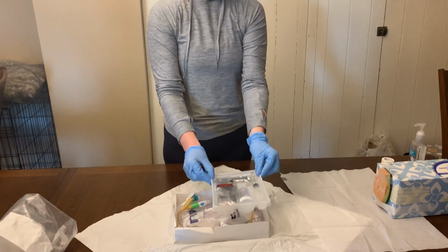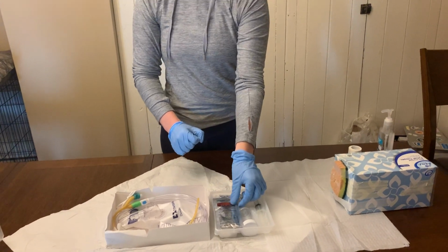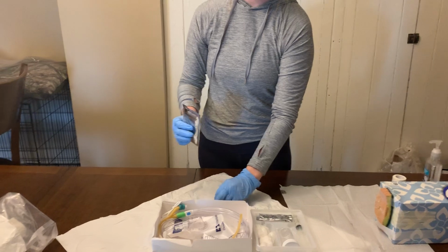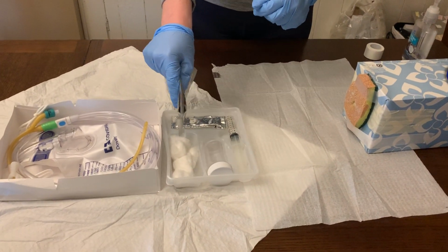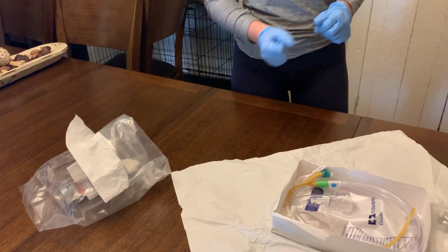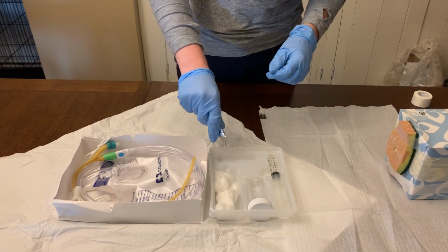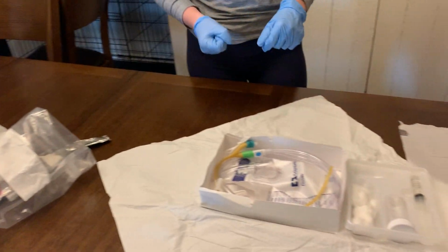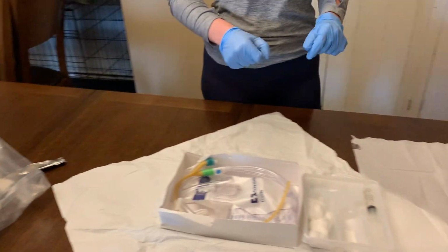So I'm going to grab my tray, and I'm going to set that out onto my sterile field here. I'm going to move my forceps. I'm going to set them on my sterile field over here out of the way. And without crossing over, I'm just going to put my antiseptic solution on my cotton balls, and then I'll throw that away. I'll take my lubricant and open that up, and then also put that into my tray and throw that away as well. I can also get rid of the specimen container.